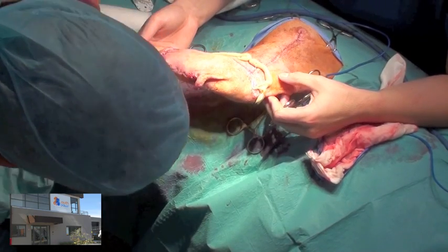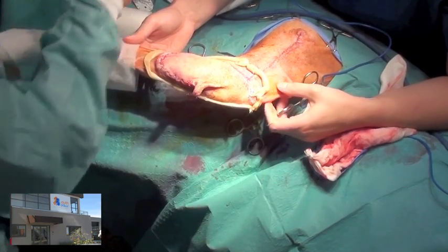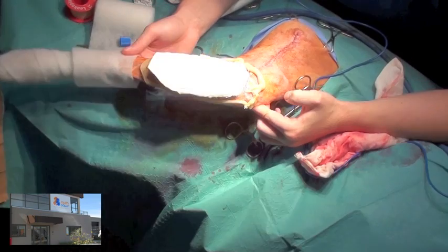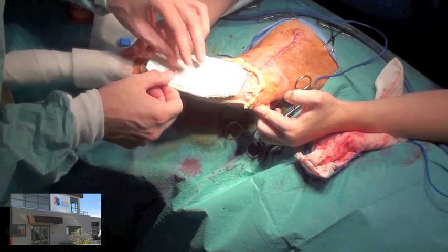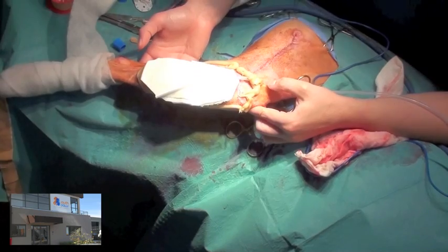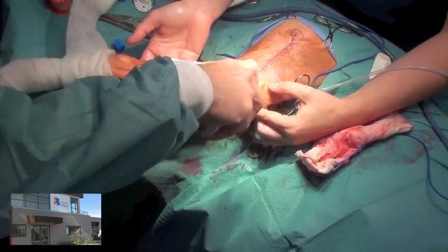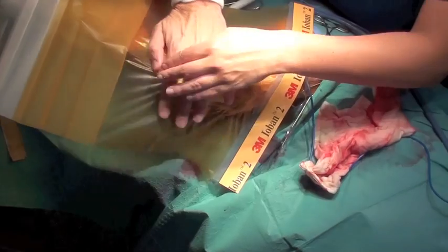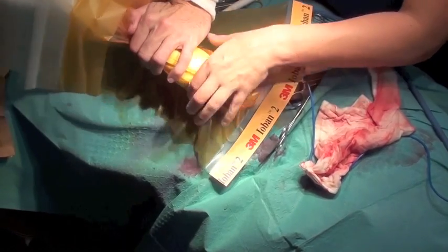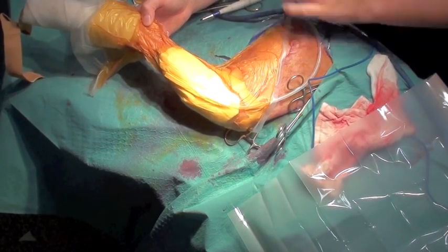Stoma paste was placed all the way around the flap in order to provide an airtight seal for vacuum assisted closure. A laparotomy sponge was placed over the flap. The entire area was then sprayed with an op-site spray to encourage adherence of the op-site material. An ioban drape was placed over the entire wound and the colostomy paste. Suction was then applied to confirm that there were no leaks.